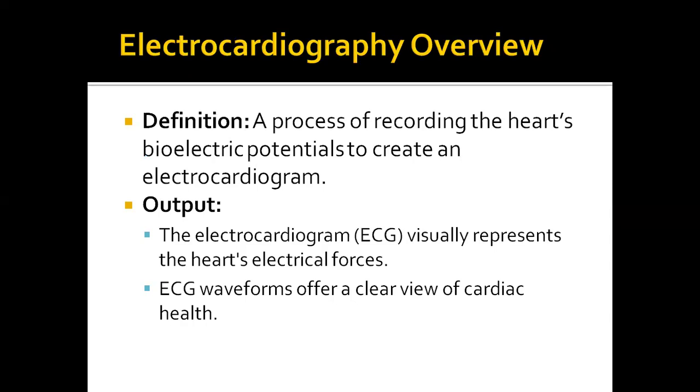Electrocardiography involves recording the heart's bioelectric potential to create an electrocardiogram. This output, commonly referred to as an ECG, gives us a graphic representation of the heart's electrical pulses. By analyzing these waveforms, we can assess cardiac health, identify irregularities, and guide treatment decisions.